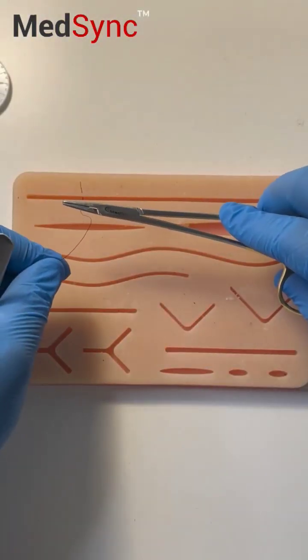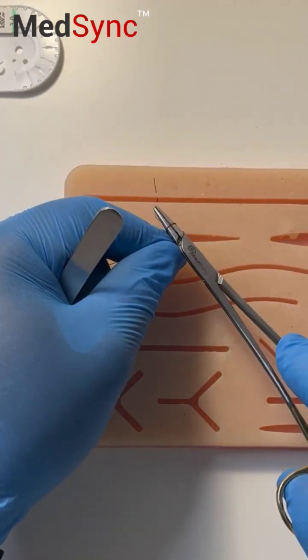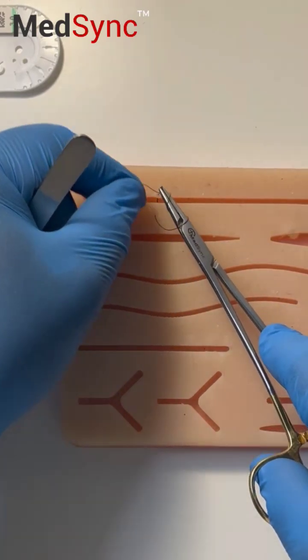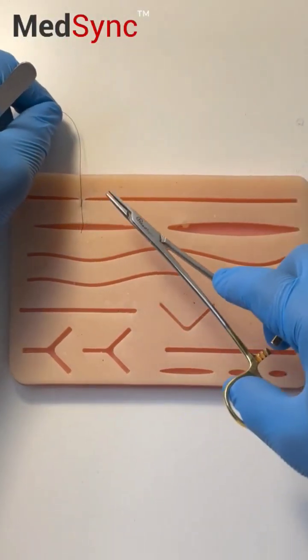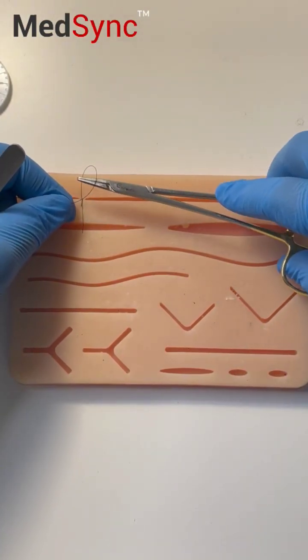Wrap the suture just around the tip of the needle holder by pushing forward. Your surgeon's knot and tie. You pull it forward. It makes the loop for you. Put the needle holder in between.